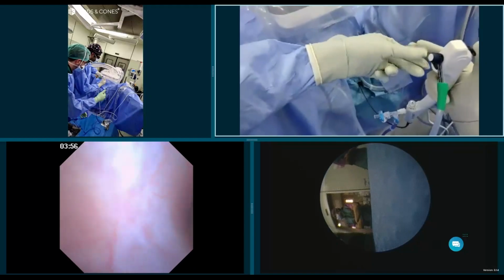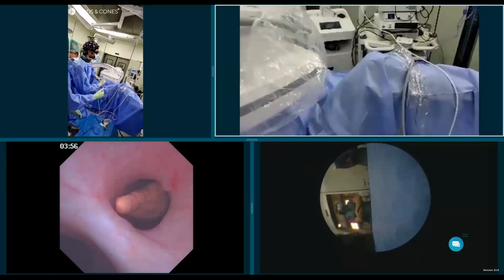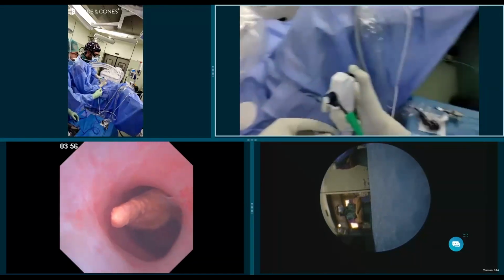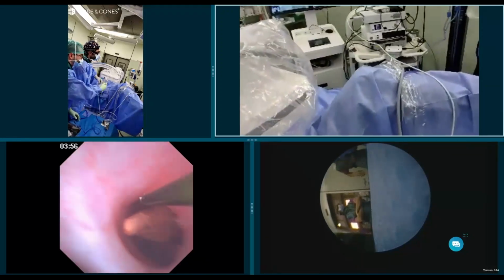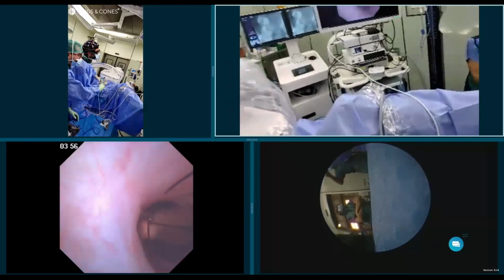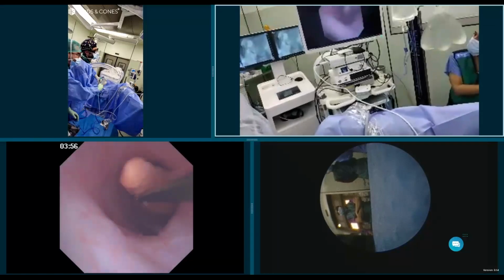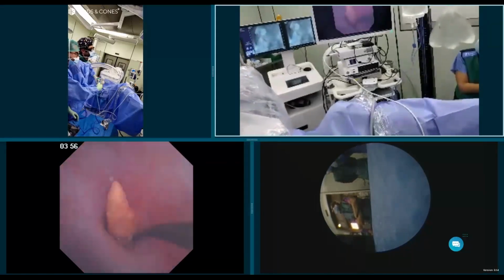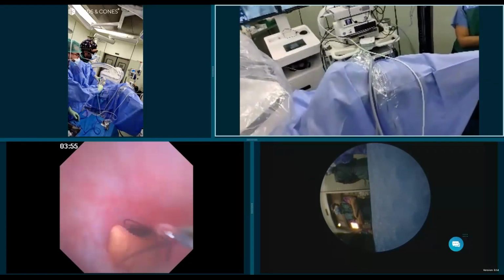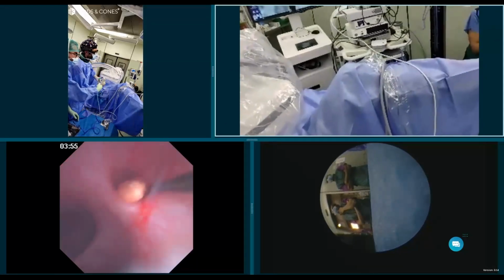So I grab it with 2 fingers here, and I put my basket. This is a 1.9 basket. It's good. I like this because then if there's something wrong, you can put your guide wire in here. Open the size of the stone, not too much. Open. Good. Close. Okay, it's too big. Open. Abre. Too big. Close. Open.